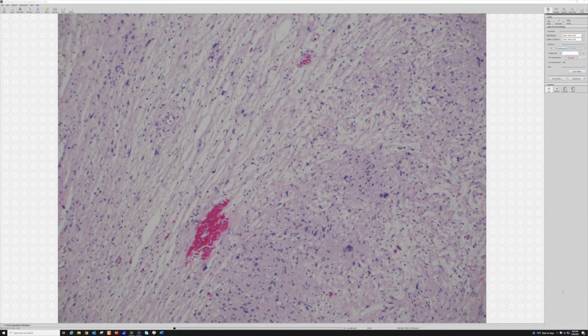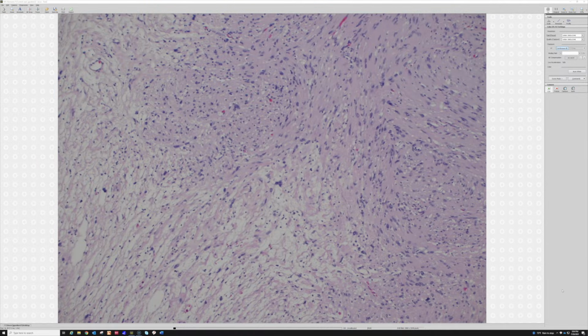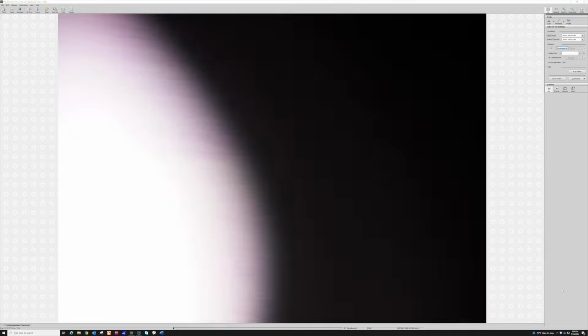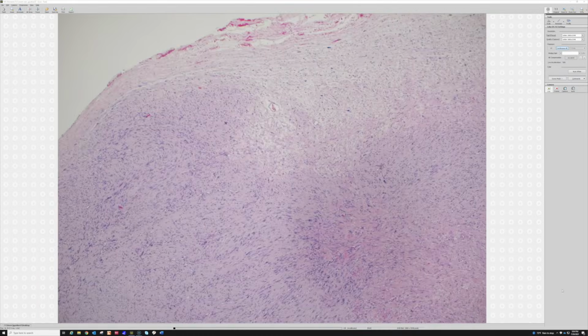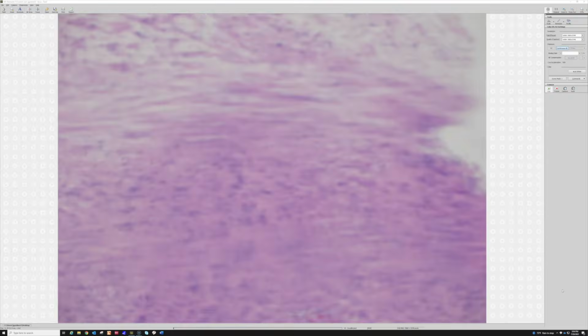And those ones that get really bloody and have a lot of vascular changes, I find they really confuse people, because the blood and the cystic formation really makes people think of vascular stuff and other things, not schwannoma. So I don't have a good example of that handy to show. But in any case, those are all features you can think of. And that was the best.